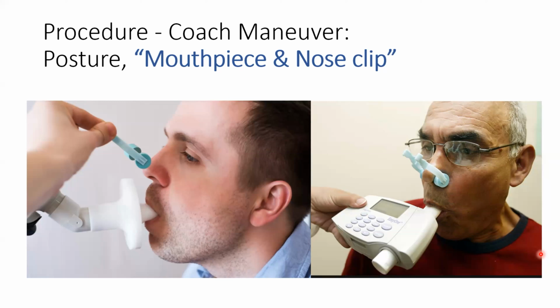A nose clip is not mandatory for forced expiratory maneuvers. Some patients prefer to hold their nose with their fingers. However, occasionally subjects blow out or inhale through the nose, so it is safer to always apply a nose clip. If the nose clips won't stay put on their nose, try an alcohol wipe for their nose.